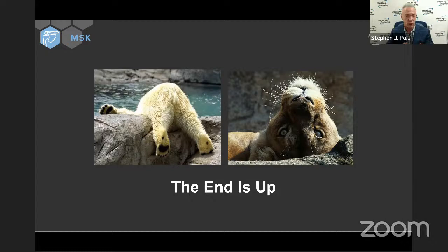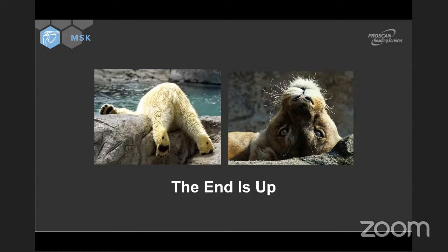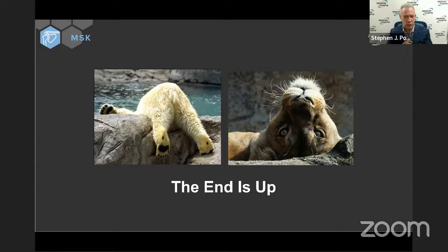When would you use GAD for the elbow? Usually when I've had too much tequila, I will give GAD for the elbow. I hardly ever give gadolinium. Now, if I have a lesion that's, say, a cystic lesion, and I'm not sure if I have a ganglion or a myxoma or a schwannoma, and I need to see enhancement, then I will give gadolinium. I rarely, and I mean rarely, will put gadolinium into the joint.